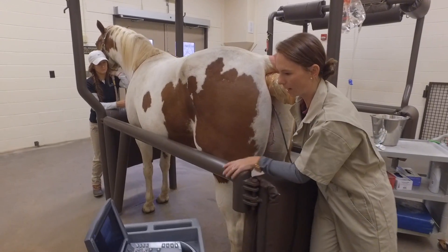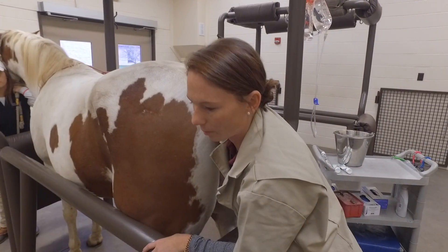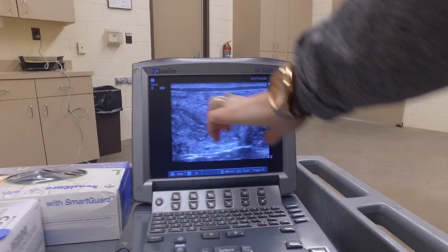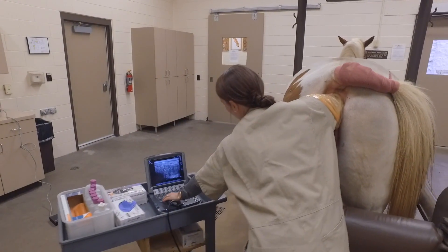So I'm just going to scan her entire uterus, make sure there's no fluid, nothing abnormal there, and make sure everything looks good before flushing her today. We have the uterus right in that area there — no signs of fluid.